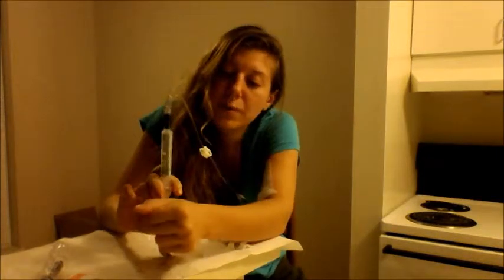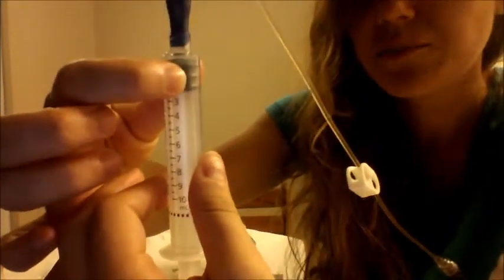Infuse. With this one you're going to do a pump — I do about three notches at a time. If this process bothers you, you can go slower; it's not a race, just do whatever you need to do. For the whole time, check for air bubbles. I'm going to go up to just past one — one notch past one. The top black ring is touching this very top black line right there above my finger. The top ring is touching that line. Done.